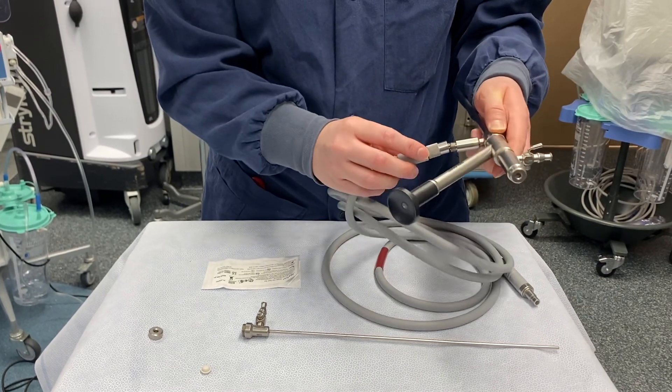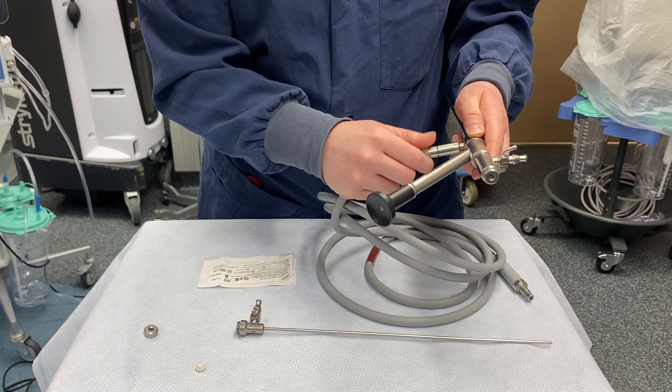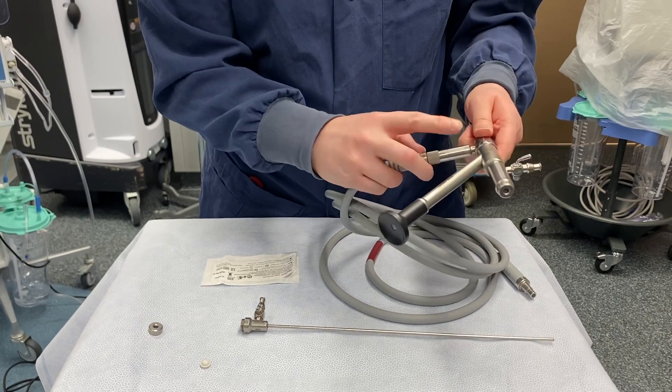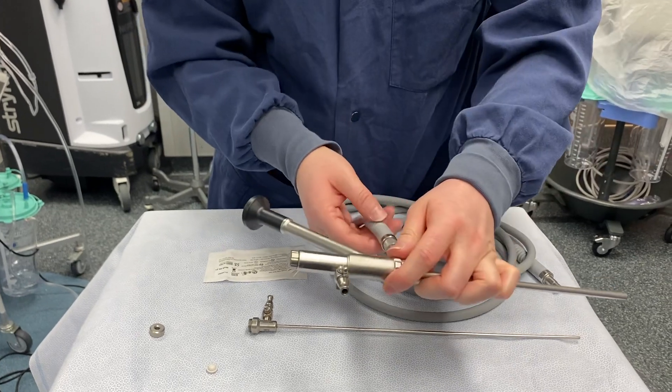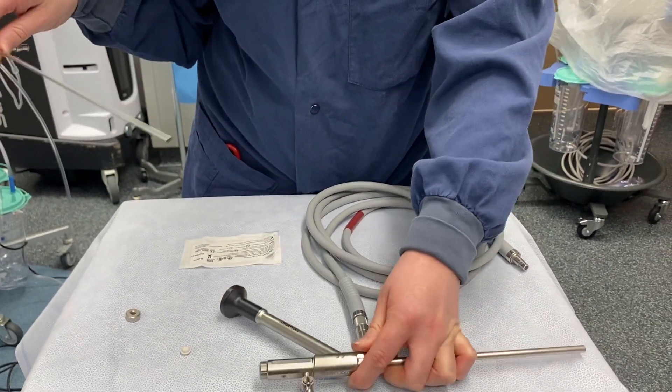We can just put on our light cord. You want to make sure the light cord adapter comes off of the scope for processing and does not come back up with it on.